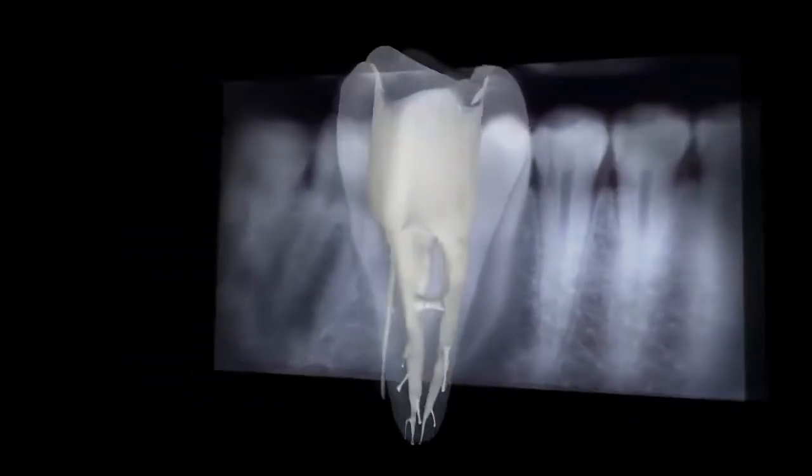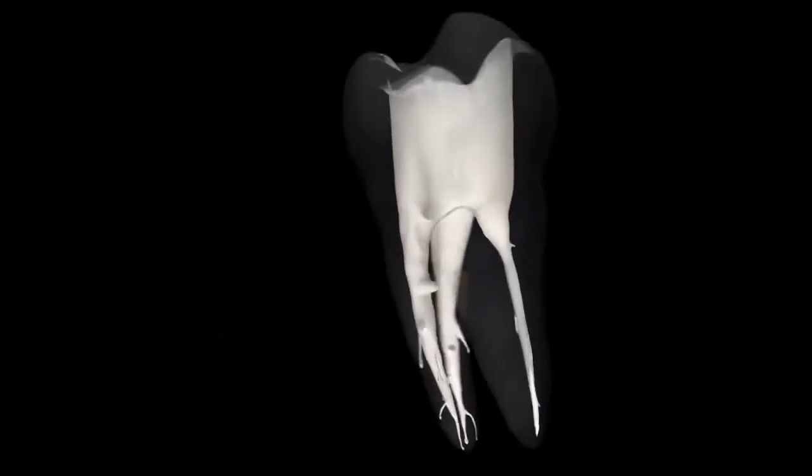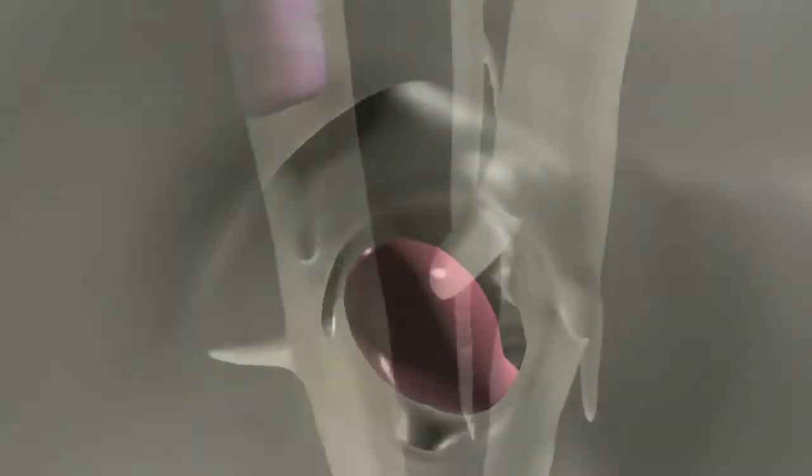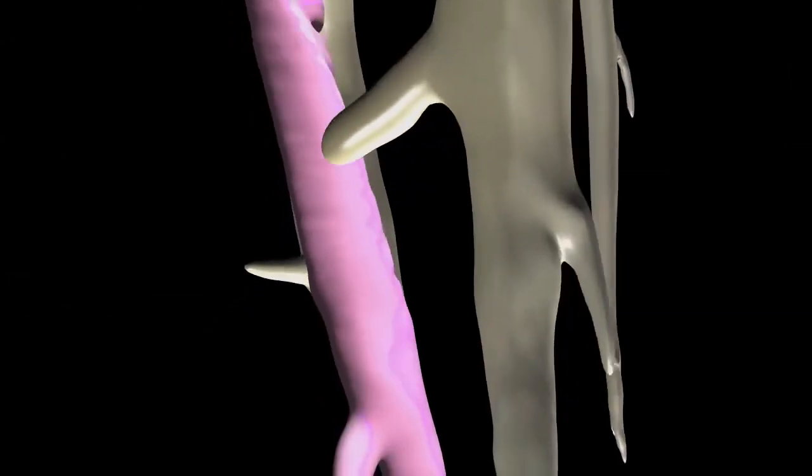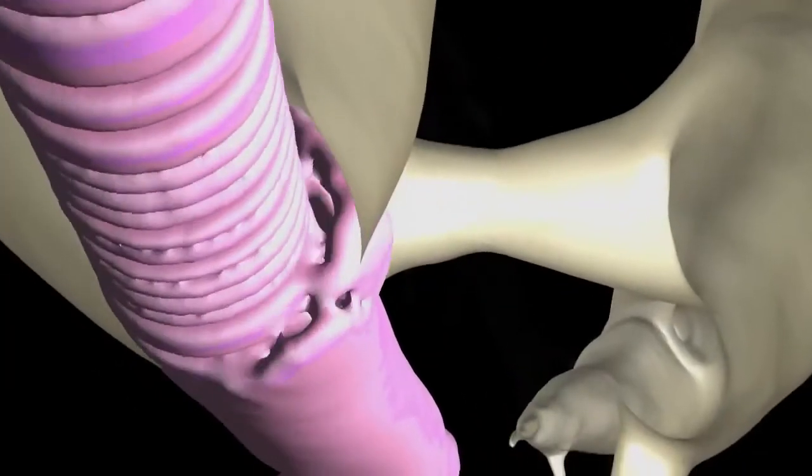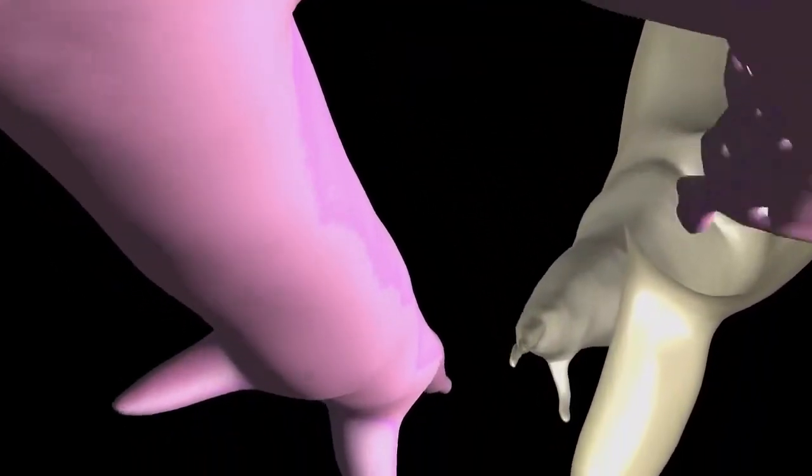Place gutta-core into the root canal system in one smooth motion without excessive force. The cross-linked gutta-percha core centrally compacts the alpha-phase gutta-percha with a hydraulic force that sends it flowing in three dimensions into laterals, isthmuses, and accessory canals.